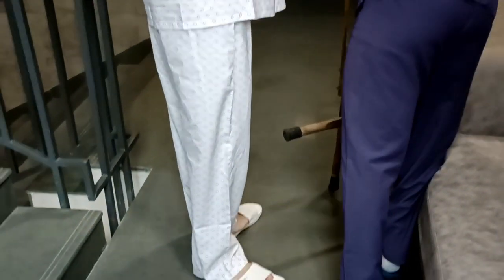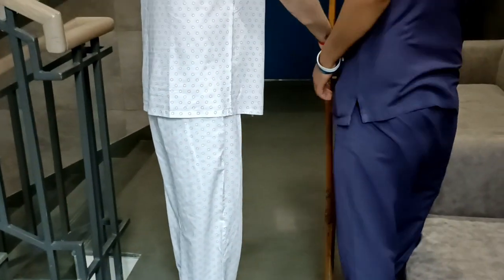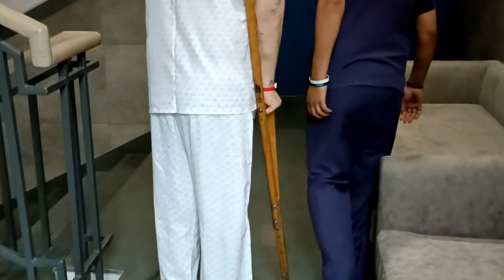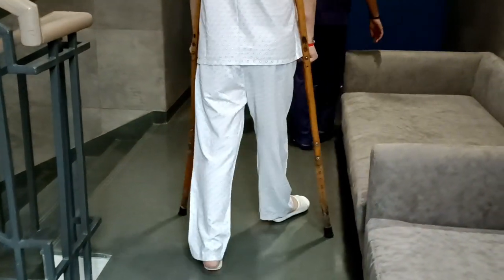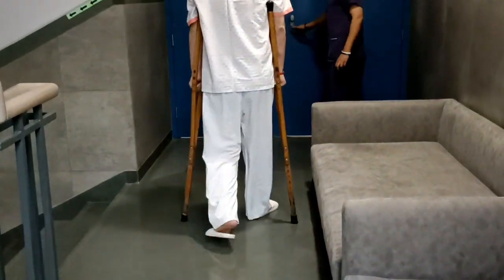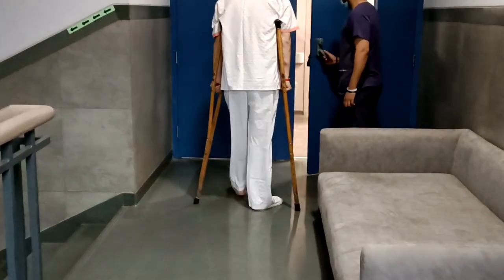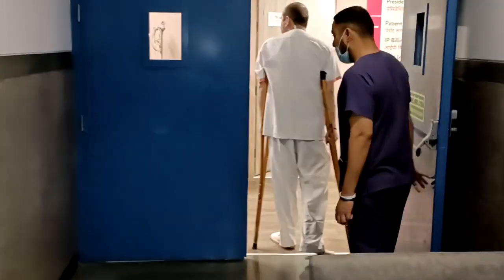So we are doing both his knee replacements by robotic technique with an MIS approach and we will give him the maximum benefit of surgical expertise as well as the technology.